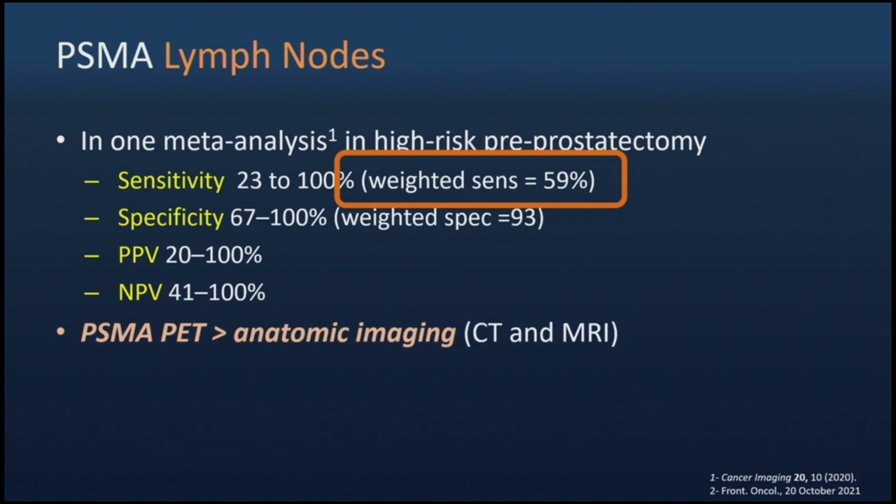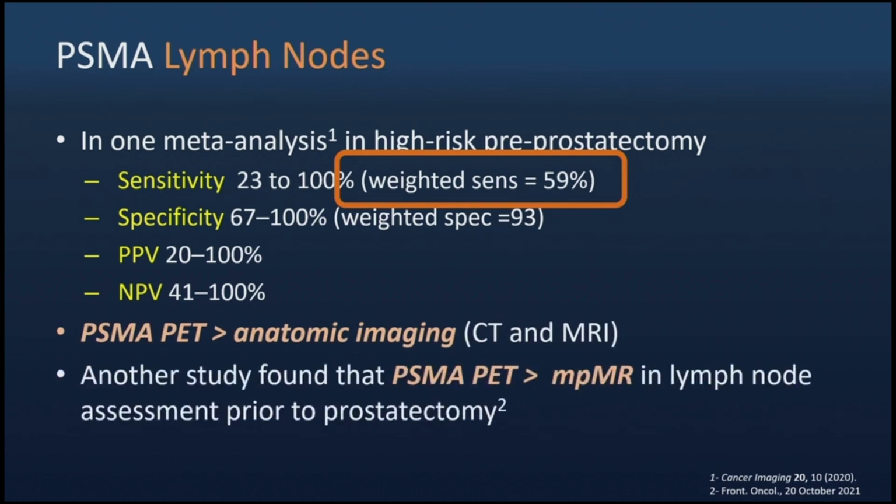We're a lot better than where we were, better than CT and MR. And what about if we add the multiparametric MR? Still better, right? So we're a lot better where we are. We haven't gotten 100%, but definitely a lot better than we used to be.